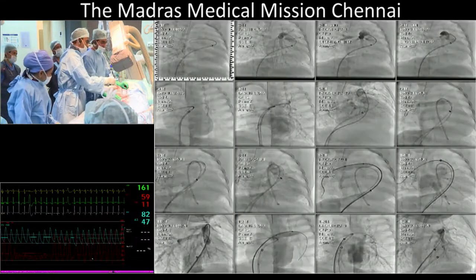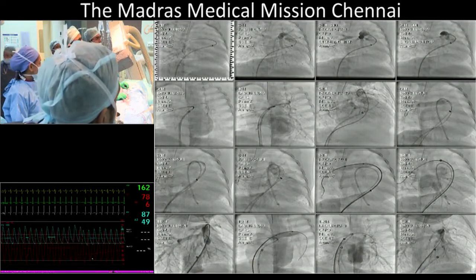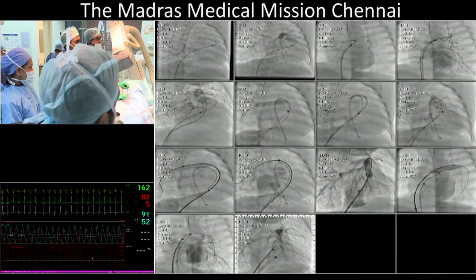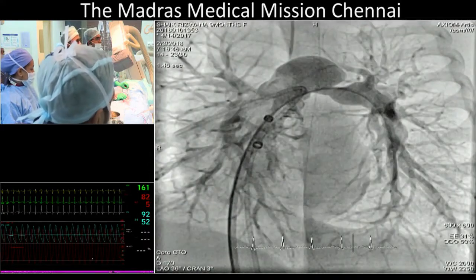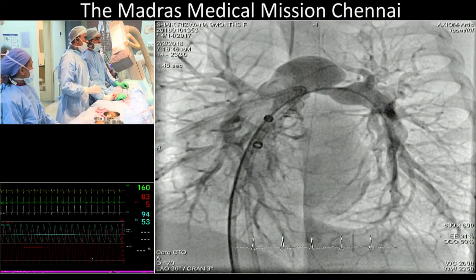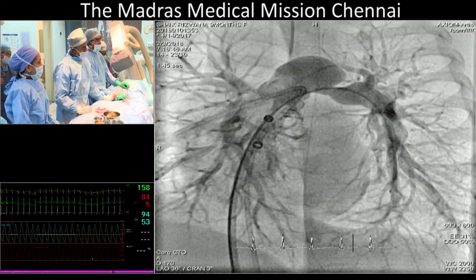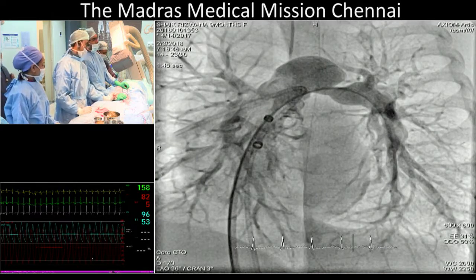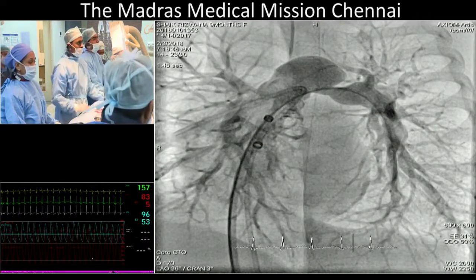Show the previous LPA, the last left pulmonary artery picture. No, the previous. Freeze it. Actually, there is no peripheral pulmonary artery stenosis beyond the hilar LPA. In fact, after the hilum, the whole vessels are looking good. Okay, well, maybe we're not seeing it very well. There are a few stenoses I can see. Just go back and forth, go 1 or 2 frames above.